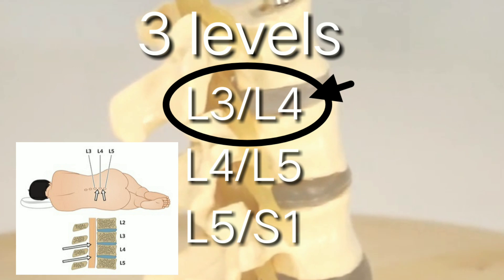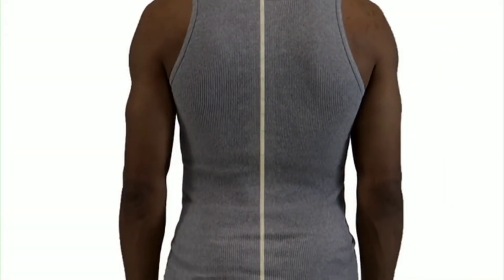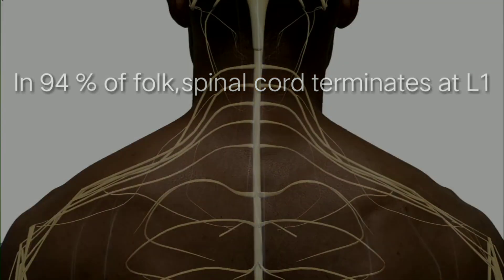L3 and L4 is the most preferential site of choice. It is mostly performed at this level to avoid injury to the spinal cord, because in 94% of cases the spinal cord terminates at L1, and in the remaining 6% of cases it terminates at L2.